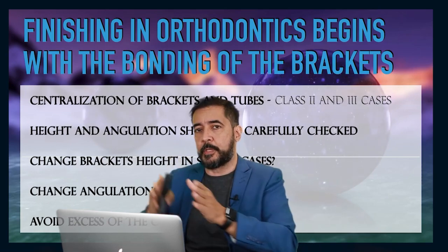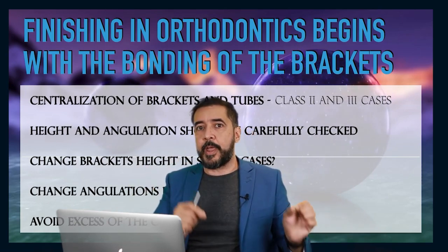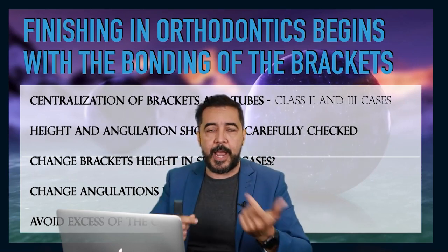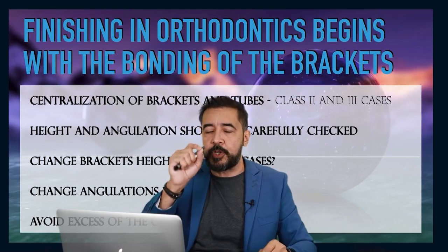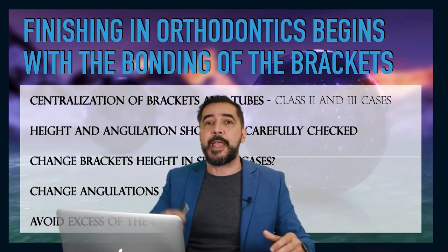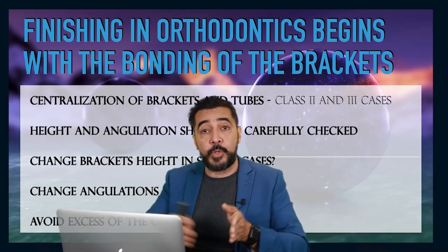And before doing the bends, we have to understand that we can prevent them, okay? We did the right bonding, we did the right positioning of our brackets or tubes, and we anticipate the errors that could have been made during the course.